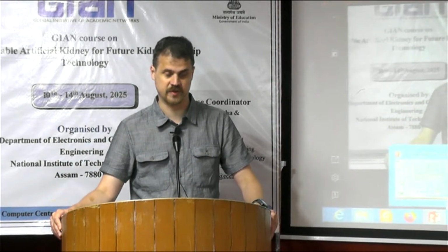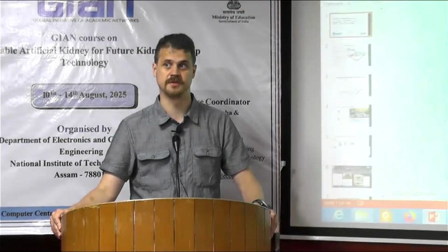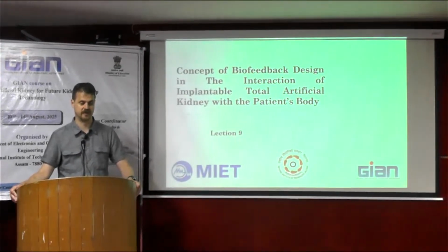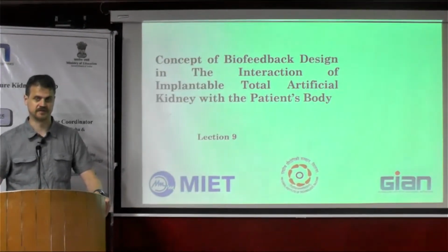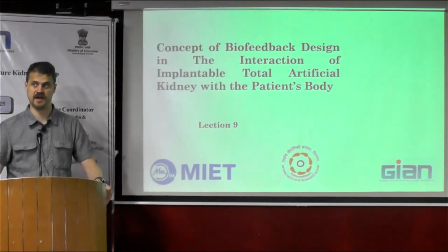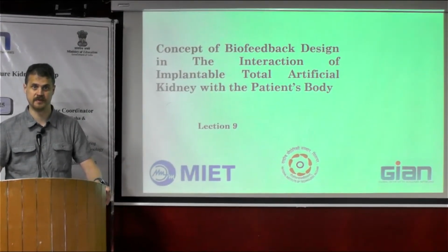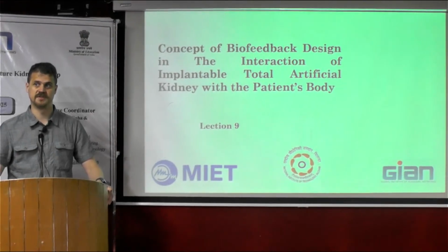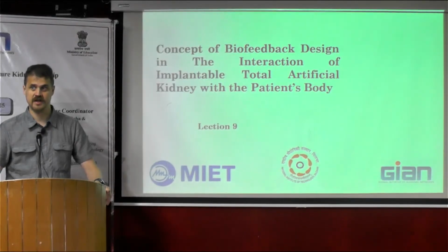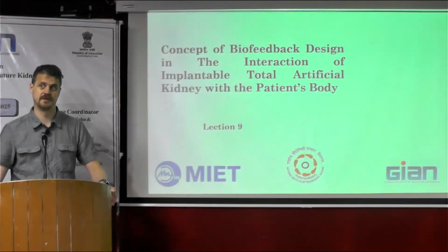Doctor, and what is required to actually achieve this sort of feedback? Because in terms of the implantable artificial kidney, we have to constantly monitor the parameters of the patient that change during the renal replacement therapy. Specifically, we need to be aware of what particular parameters of blood can be changed during the interaction with the implantable artificial kidney.